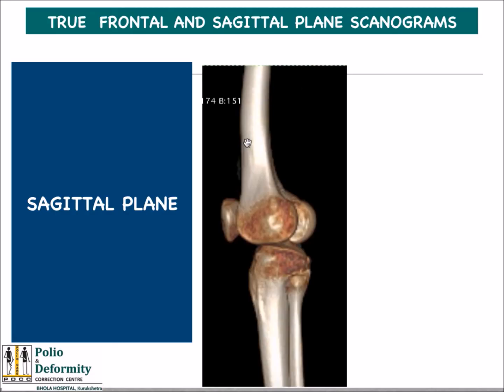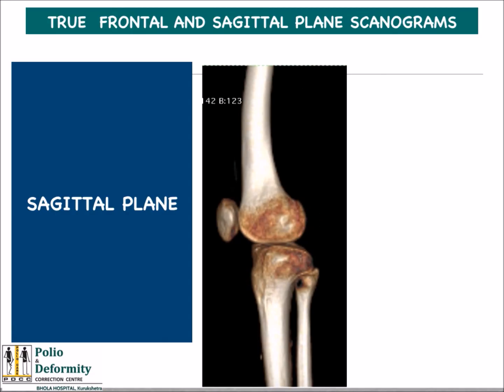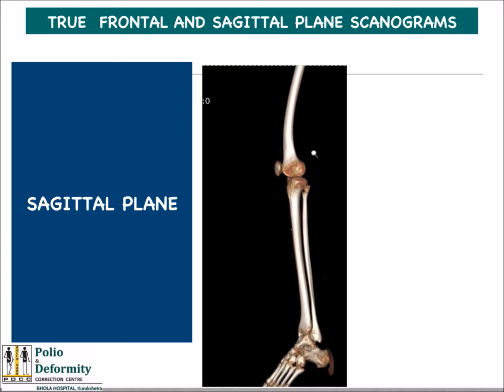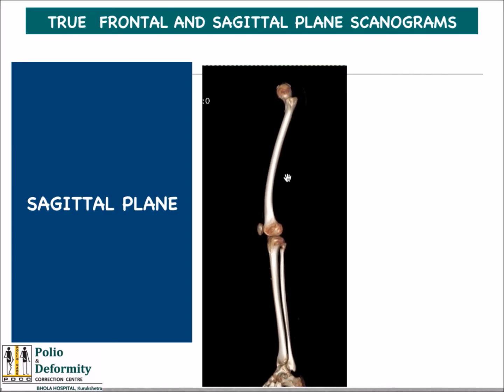One thing. Second thing, it's very difficult to get lateral condyles overlapping on one another in plain scanograms and see the upper end of the femur.